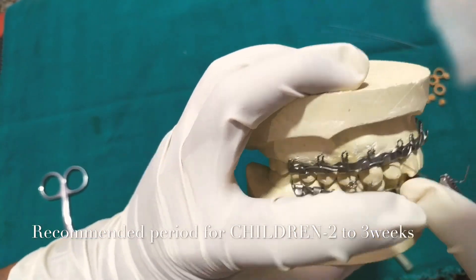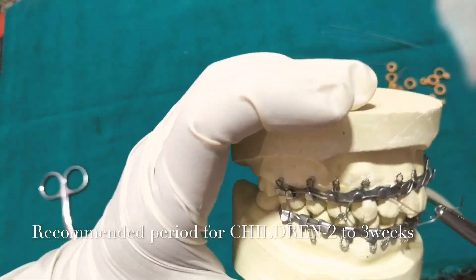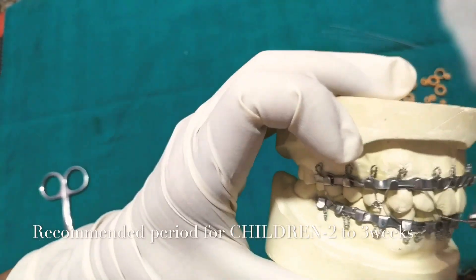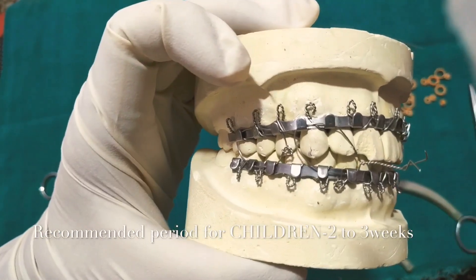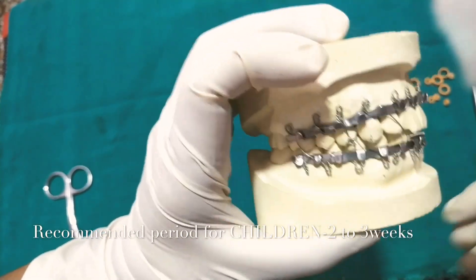Here you can see that I have taken two hooks above and two hooks below. Whenever you twist the wire, always remember you need to twist it in a clockwise fashion, as you can see in the video. During removal of the wire you need to do it anti-clockwise. Here I have done it clockwise.